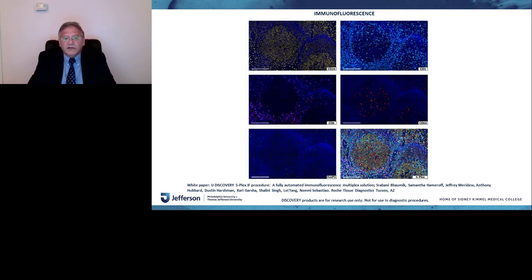Immunofluorescence has been used for decades. It actually started in the 1940s. Right now it is utilized predominantly by researchers. And in the clinical practice, we use immunofluorescence in the cytogenetic lab, specifically for the FISH probes, and also for kidney and skin pathology.